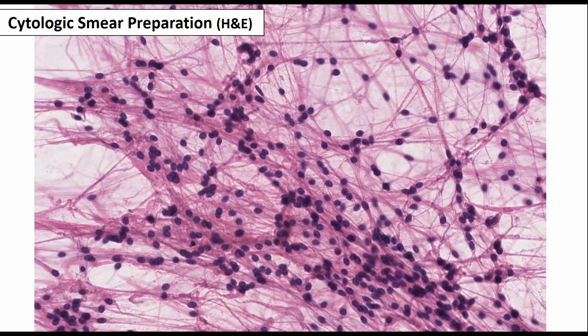Okay, now this one, what are the patterns that I would accept? If it is a supratentorial ependymoma, you could say an intraventricular mass in the ventricle. Or you could say, if it's supratentorial, a well-circumscribed mass in the cerebral hemisphere, extraventricular. Absolutely. This is called half more or less of ependymomas, supratentorial, have no connection to the ventricle.